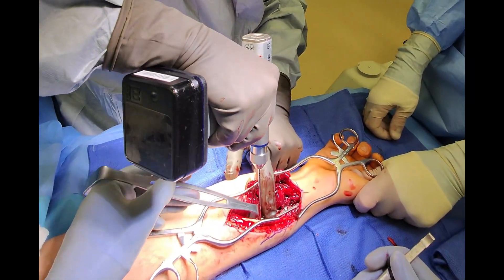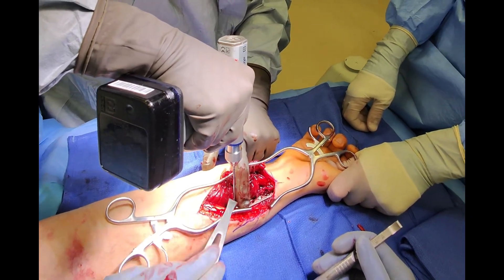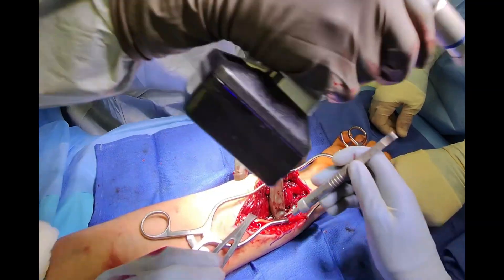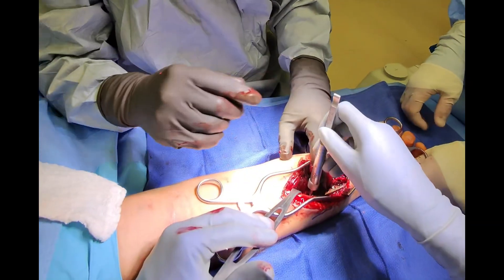Directly through pre-engineered holes in the plate, we drill through both cortices of the bone and then use a depth gauge to measure the length. We can then insert the appropriately sized screw for fixation.